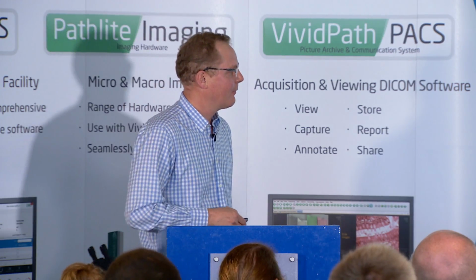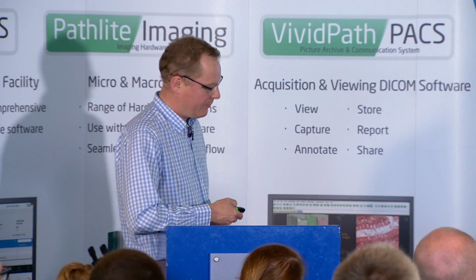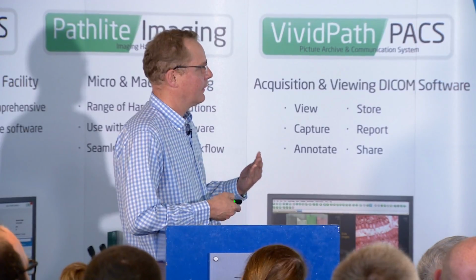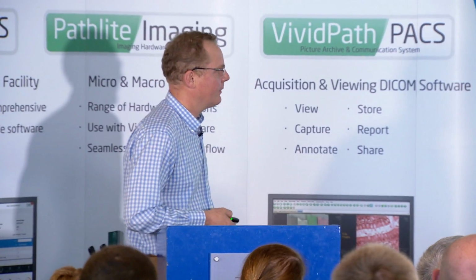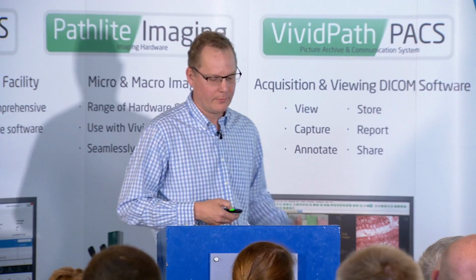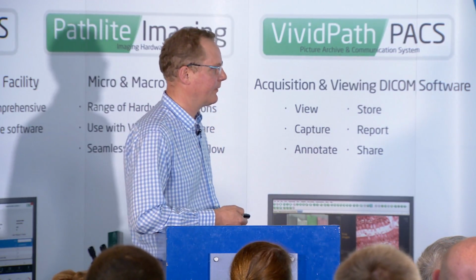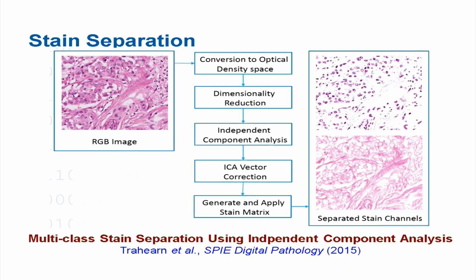There are some basics worth pointing out, and this is to do with a lot of what Richard said about how the computer looks at things and how the human eye looks at things are very different. The computer likes to have things standardized. It likes to have the color the same intensity time and time again so it can make the same measurements. So whenever you're doing algorithm development, it's very important to build in right at the start a system that standardizes the stain that you're looking at and analyzing.